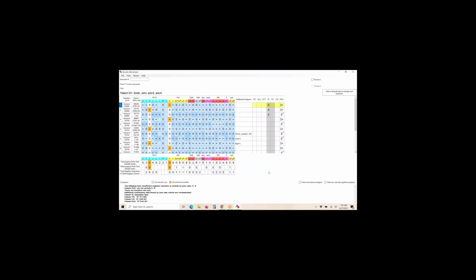Or once you're finished saving it, there is a place up here that you can review your panels. I'm logged in as administrator, so I can review my own work, but normally you would have someone else review it if you require a review. And you can have 2 people review it, and it'll document the person that reviewed your panels.